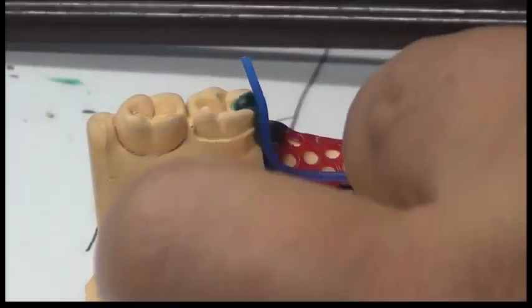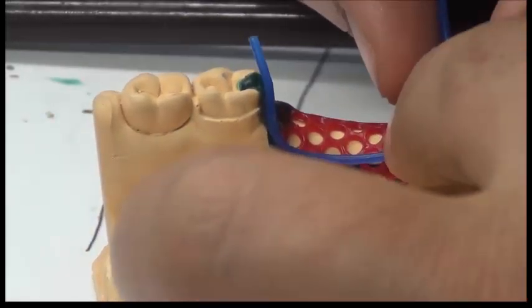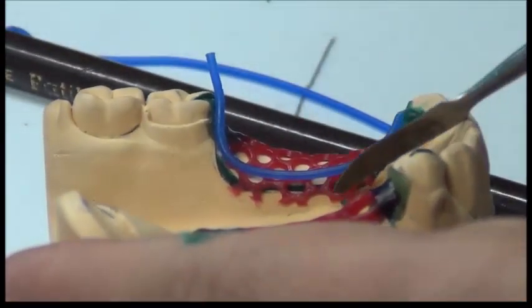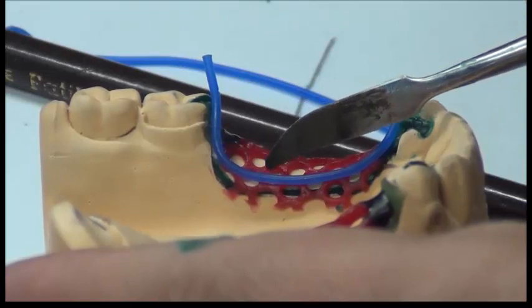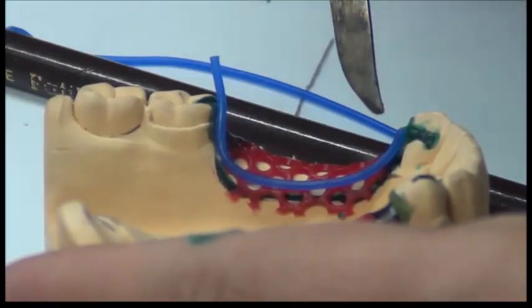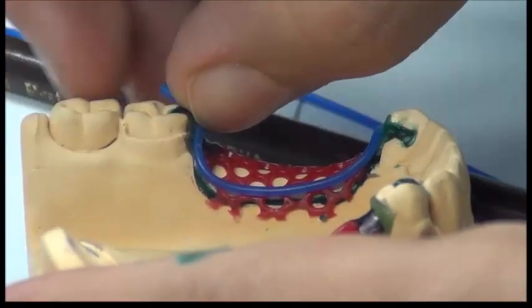be added. Now going to the canine area, I'm going to add in and remove the excess. So it's like a rectangle. If I look at it closely once more, this is the internal finish line down here, okay? This is the width of the teeth that I need for the teeth to be added. So it's in between the marginal gingiva of the teeth and the internal finish line, and it runs vertically to meet the guide plate from the lingual side of both sides. Okay? This is easy for the bounded saddle. It's similar to the upper.